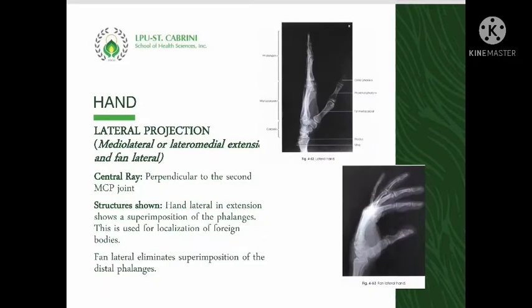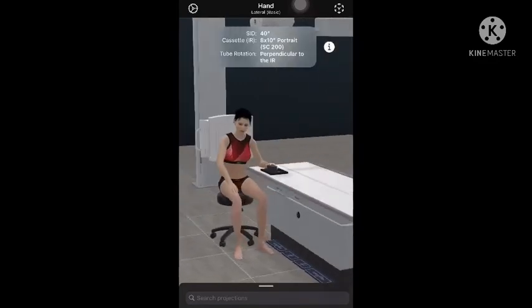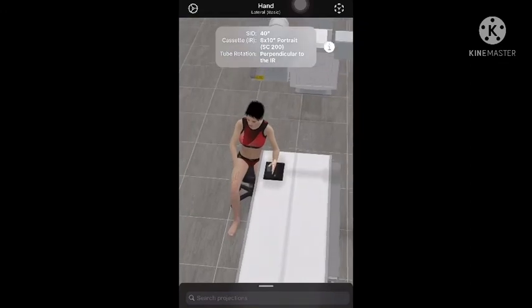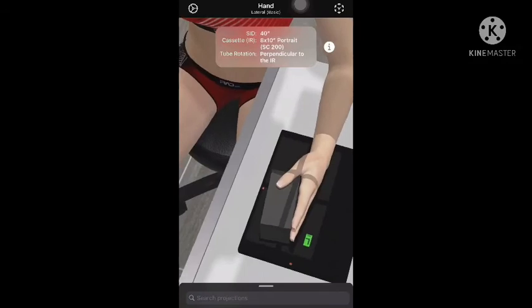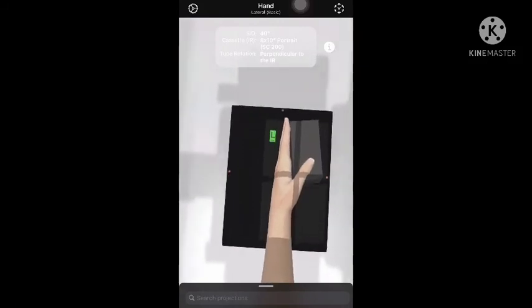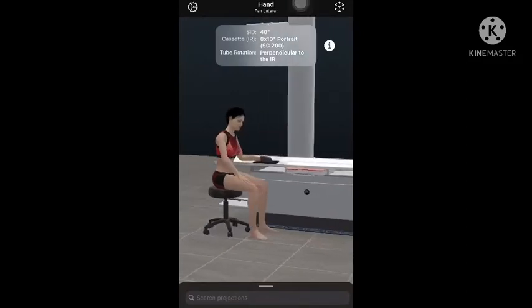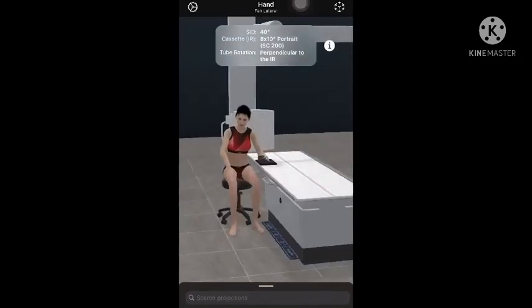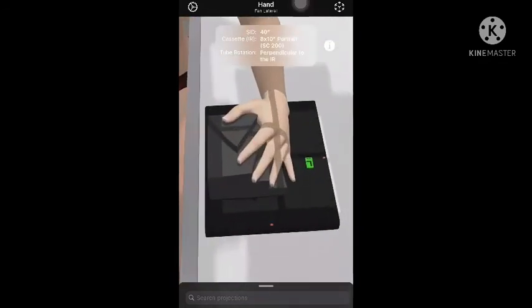For both positions of the lateral projection, the central ray is directed perpendicularly to the second metacarpophalangeal joint. This is a demonstration of the hand lateral in extension, lateral-medial projection. A sponge wedge can also be used as support to secure its position. Fan lateral is a modification used to eliminate the superimposition of the proximal phalanges seen in lateral in extension.